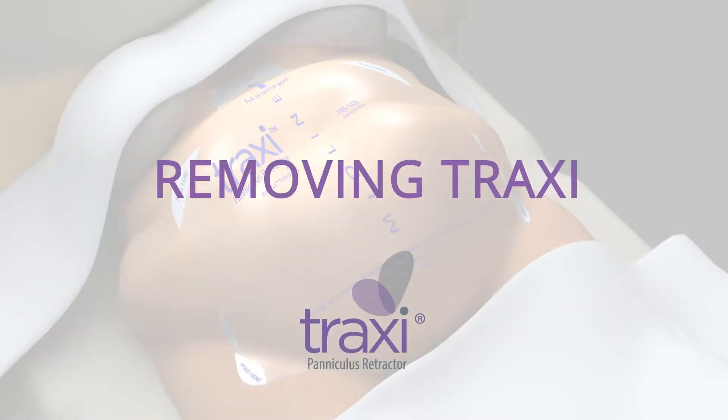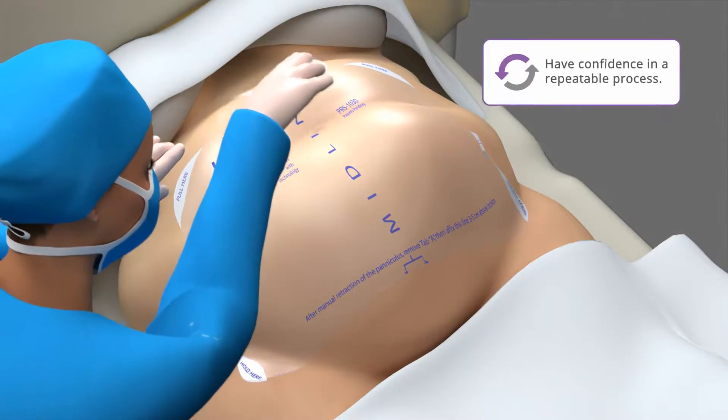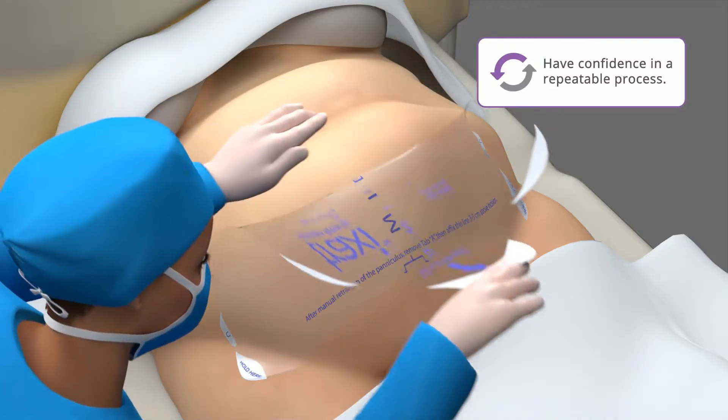Application and removal of the Traxi are both quick and easy. Beginning at the top, peel the Traxi down away from the patient. Remove it slowly while supporting the skin.